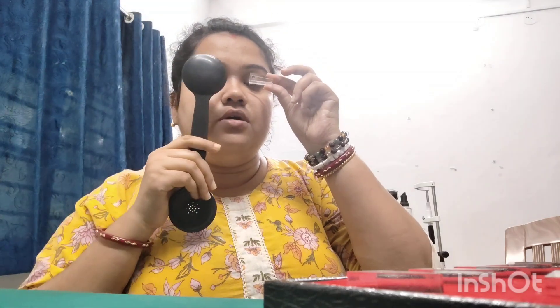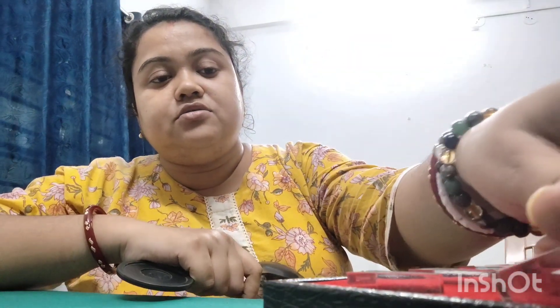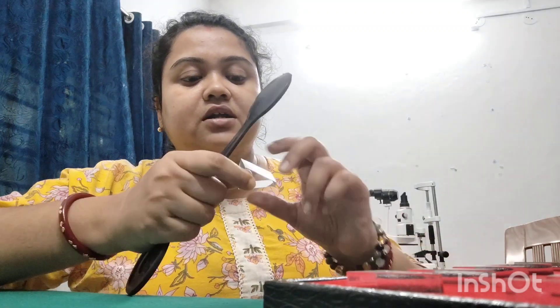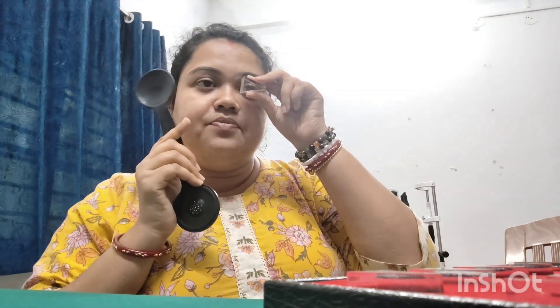Place the prism base-in to measure. You will see some of the deviation is minimized a little. Continue the test with increasing amounts of prism until you find ortho deviation. With 5 prism base-in the deviation decreases a little, with 10 prism a little more, but still not neutralized — keep increasing. Suppose with 30 prism you get the final ortho. Perform the alternate cover test with the patient fixating a target at 40 centimeters to find whether it is becoming ortho. This way you find the amount of squint — the amount of exotropia — at near.